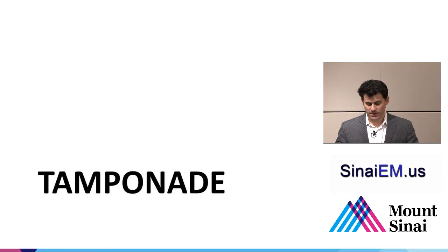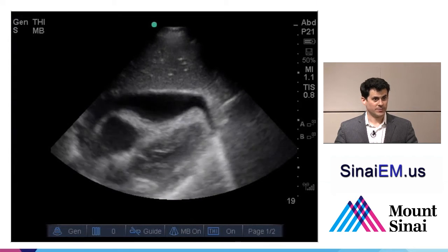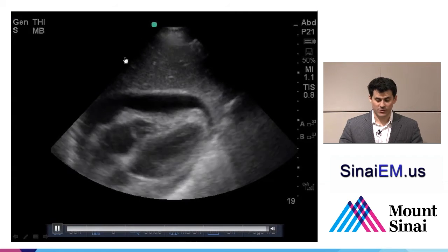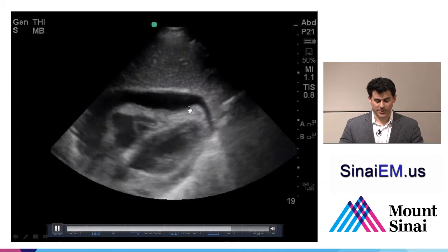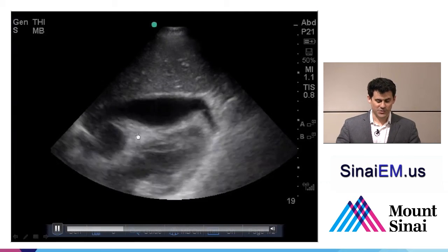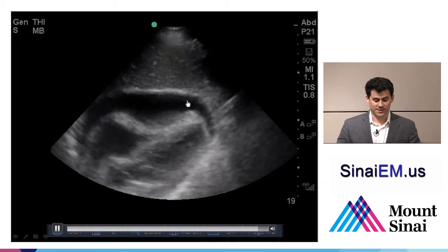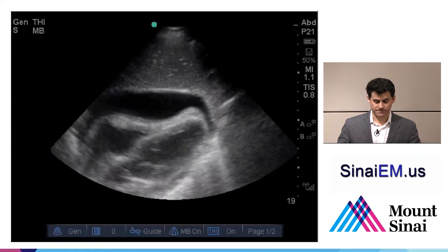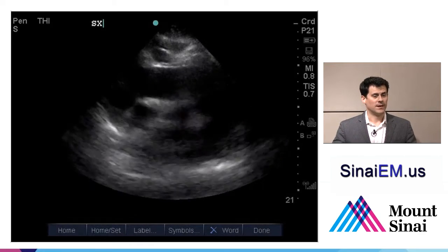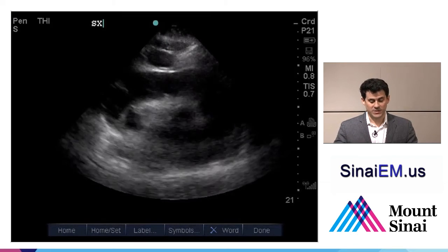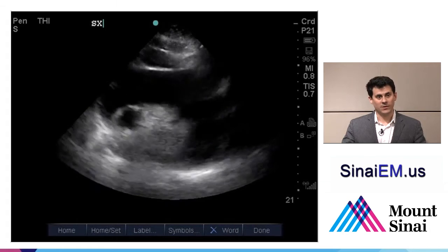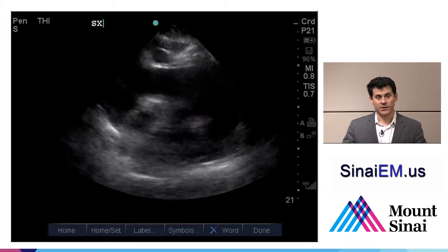When effusions become large enough to overcome the pressure the heart generates, you can see tamponade. The most commonly described classic sign is right ventricular collapse. Here in a sub-xiphoid view — liver near the top, pericardium just beneath — we see a pericardial effusion extending all the way around the heart. The right ventricle, which should be opening during diastole and closing during systole, is essentially closed through the entire cardiac cycle. This is a sign of pericardial tamponade and compromise of right ventricular function.